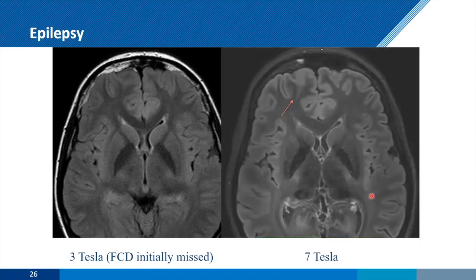And so when we took the same patient at 7T, again, here's where your extra signal to noise really comes in. And you can see here where the arrow is, we can see this over here. This is the dysplasia. It's a characteristic sign of it. It points in towards the center of the brain. And if you go back onto your 3T, then maybe you can make it out. But the confidence that the epileptologist would have in making that diagnosis is far, far higher at 7T, again, simply because your SNR is allowing you to make thinner slices, higher spatial resolution, and that's increasing your contrast to noise ratio.